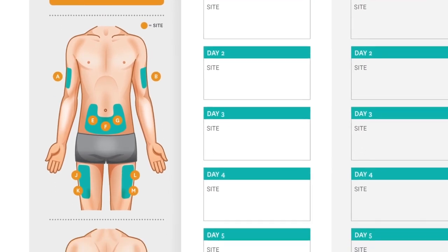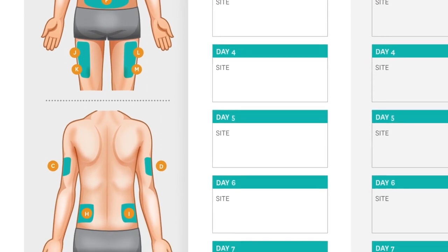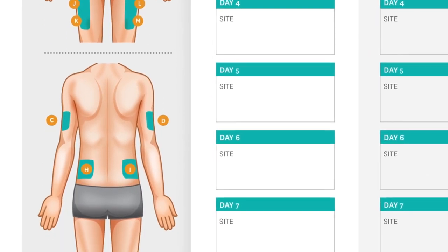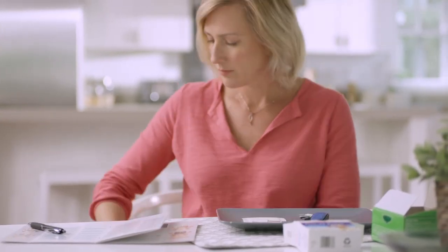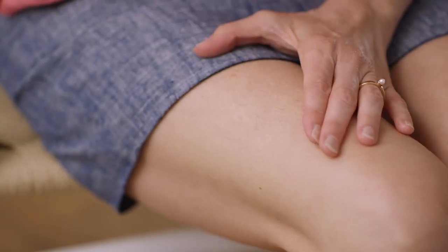Do not inject an area that is tender, red, bruised, or hard, and avoid areas with scars, stretch marks, or that are close to visible veins. Clean your injection site with an alcohol swab or wipe and let the area dry before injecting Kinneret.